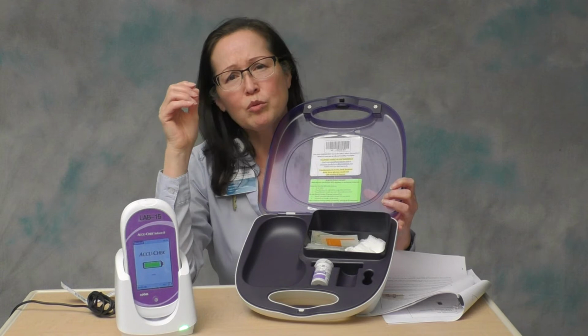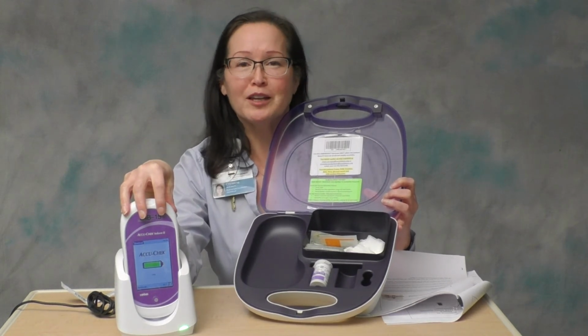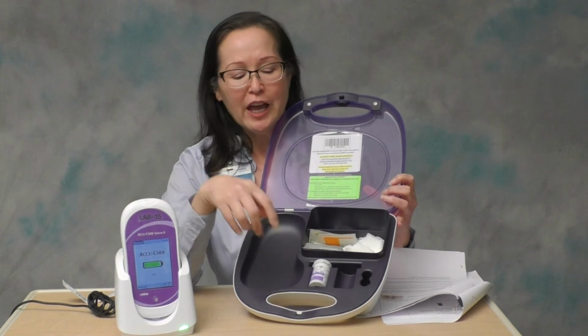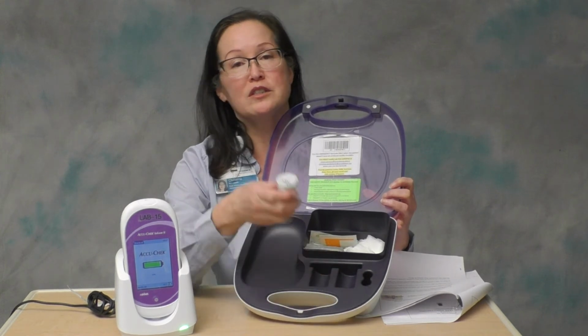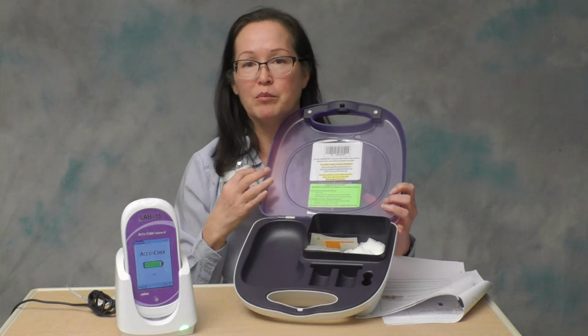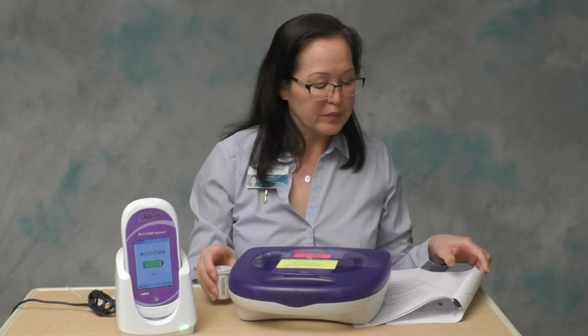So if you feel like you're running an extraordinary amount of QC, which you probably are going to feel like you run anyway, but a really extraordinary amount of QC, check to make sure that you don't have 2 lot numbers in your tote. If you do, the easiest way to get around this is to just take one of the vials out and stick it up on the shelf, so you've only got 1 lot number in the tote at a time until you use all those up.